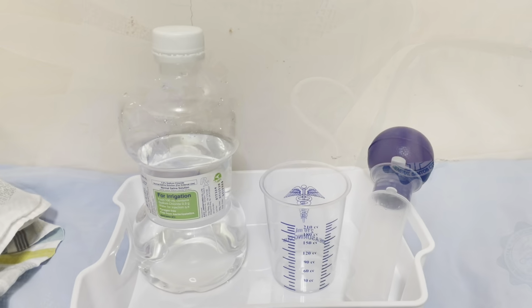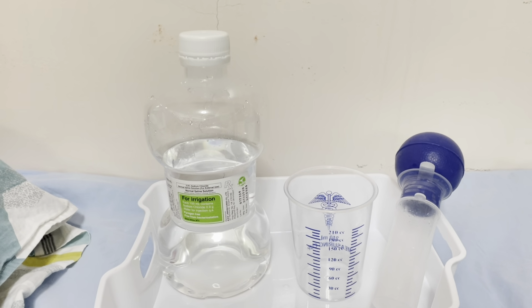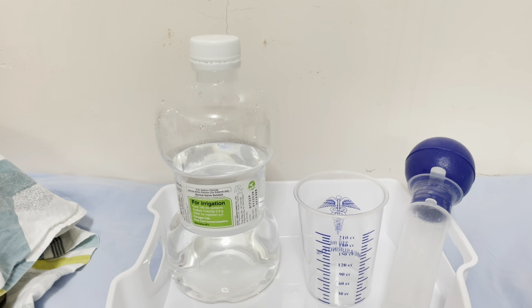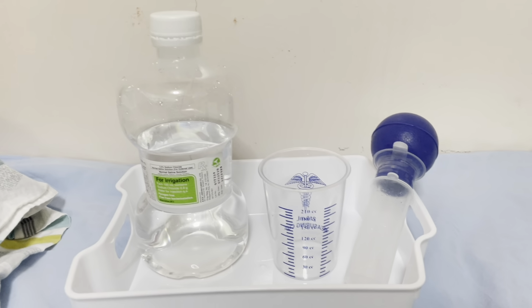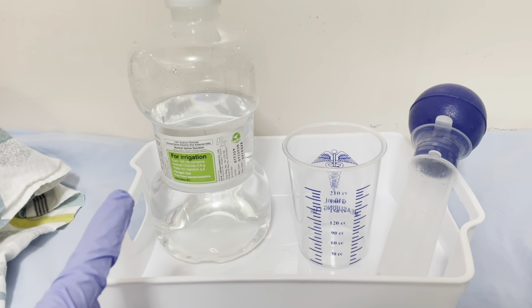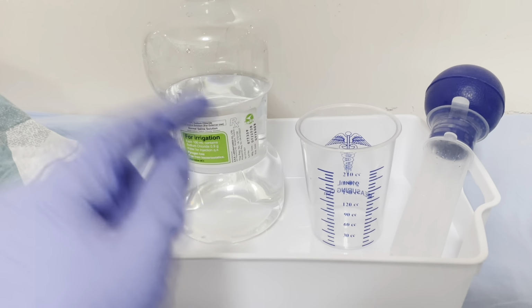The next thing that we're going to do is we're going to fill the irrigation syringe with fluid, and we're going to be asking the patient to look downward. In order to expose the sclera, we have to ask the patient to look downward so we can achieve better cleaning. Now, since here we're using an asepto syringe, we're going to first fill our irrigation fluid into a sterile cup.